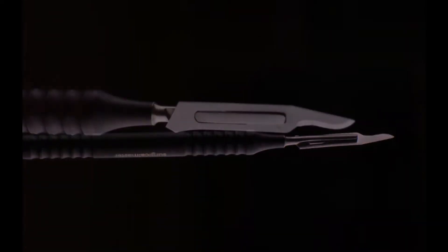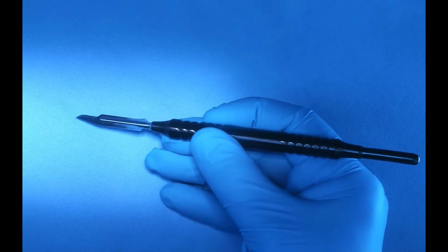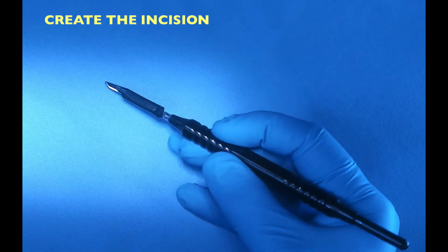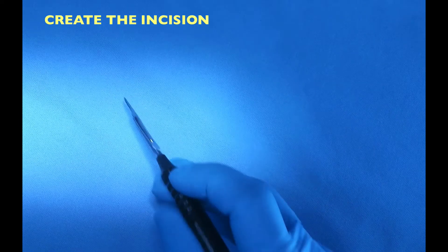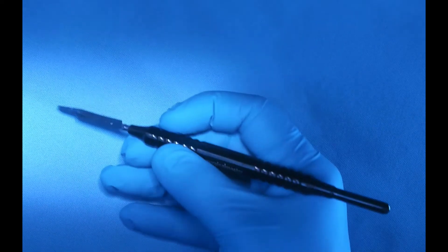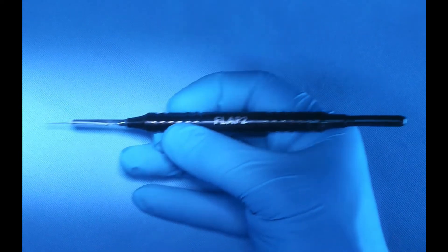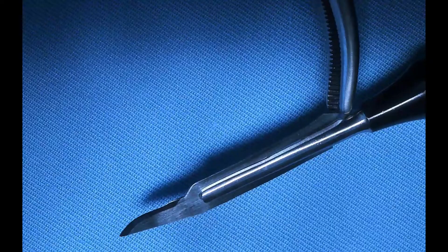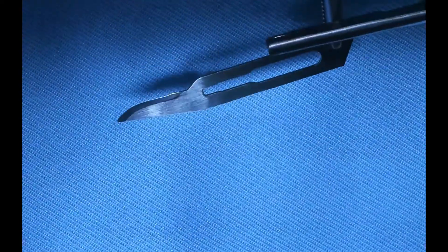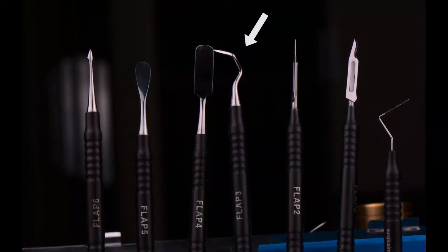The second tool in the flap instruments is your blade holder. I use a number 15 blade to create the actual incision. I like to use a blade holder that is round and comfortable to hold in a pen grasp — I can easily rotate it between my fingers for more accurate incision creation. I always recommend your assistant be extremely cautious when removing the blade to prevent injuries.